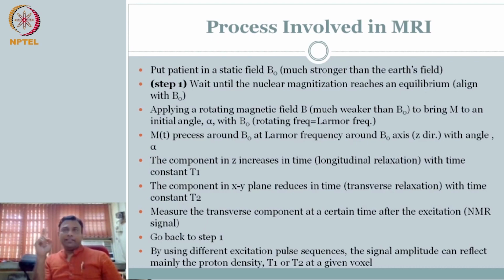So your magnetization vector has a net magnetization in the Z direction. With no further action, the components in the other XY direction are going to be random. So you're going to have net magnetization only in the Z direction. In the XY direction, it will all sum to 0 just because of the effect of only the static magnetic field.